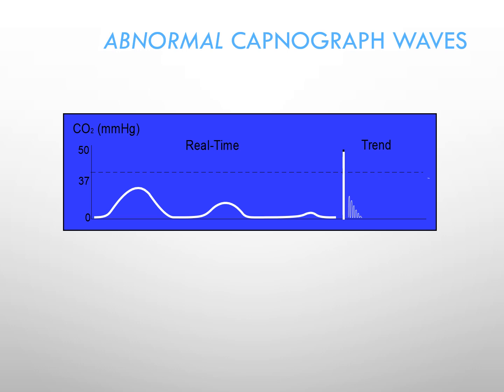The first few breaths had some end-tidal CO2 because there was CO2 buildup in the hypopharynx, the area around the glottis, but not definitively in the trachea, because we don't see a good formation of a rise and a plateau, and we don't see the repetition of this waveform.